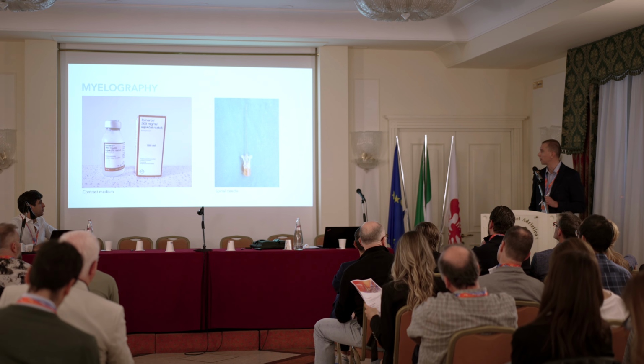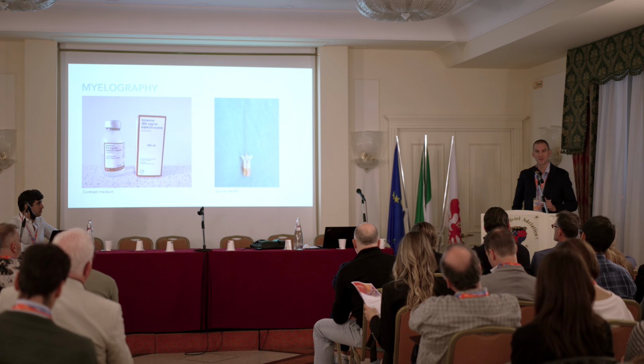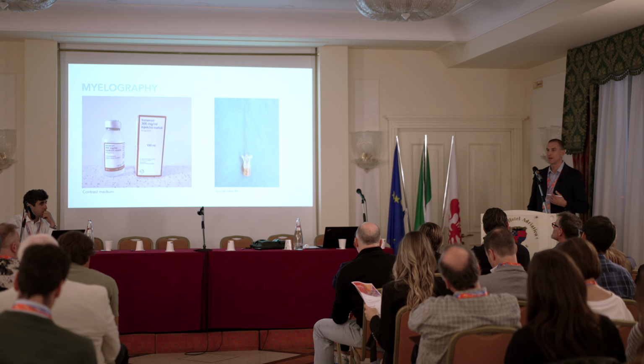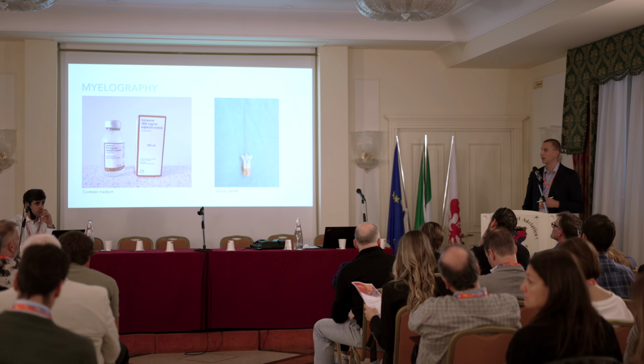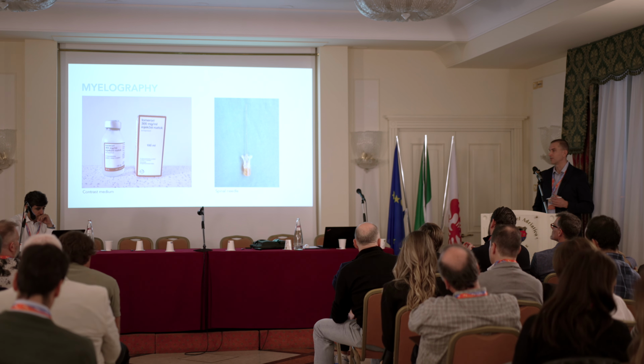And there are some amounts of contrast, usually 0.3 per kilo. I don't use it. I use a standard volume for me: small animals, usually 3 to 5 mils, medium 8 to 10, bigger or heavier, usually 15, 20.